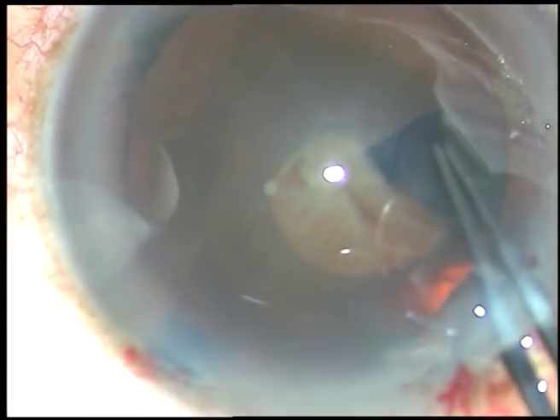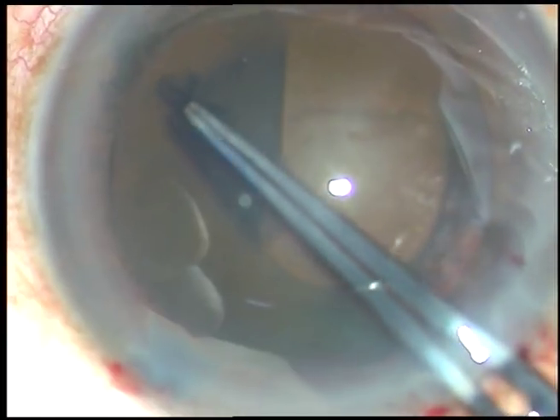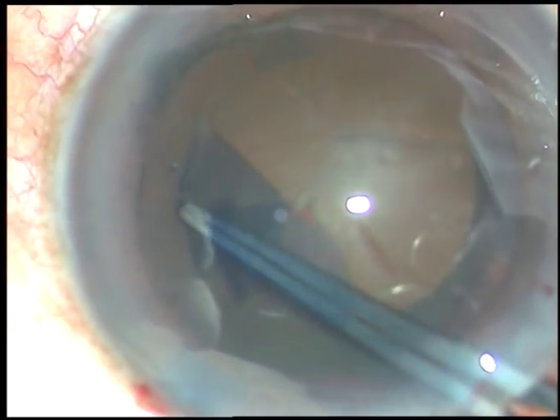And now, to capsulorhexis. The anterior capsule has been incised with a 26-gauge bent needle. Now I have taken a Utrata forceps, going around and making this rhexis.